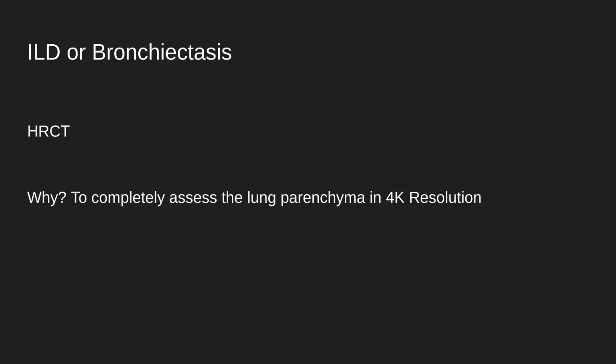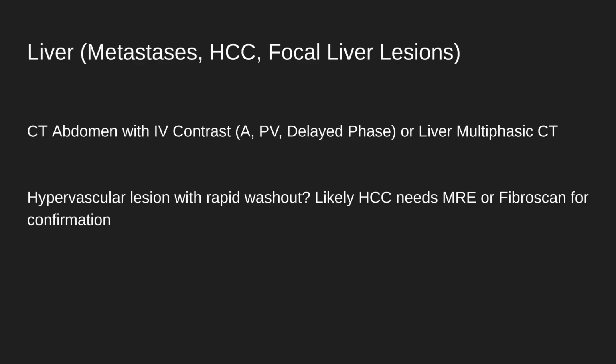And it's important to know the difference. HRCT is not the same as CT pulmonary angiography. They are not the same. HRCT is without contrast. It is there to assess the lung parenchyma. While CT pulmonary angiography for PE is there to visualize the blood vessels with IV contrast. They are two completely separate entities. And that's important to clarify with people outside of radiology, because they get confused between the two. But anyway, in HRCT, if you suspect fibrosis, go ahead. Why not?